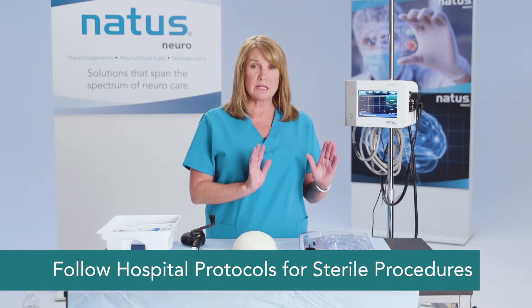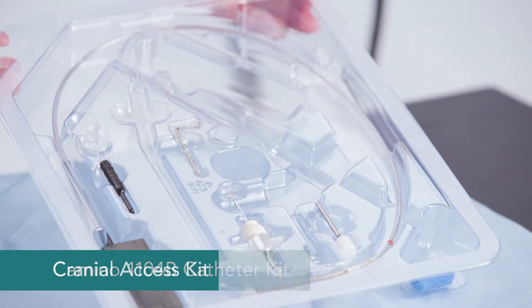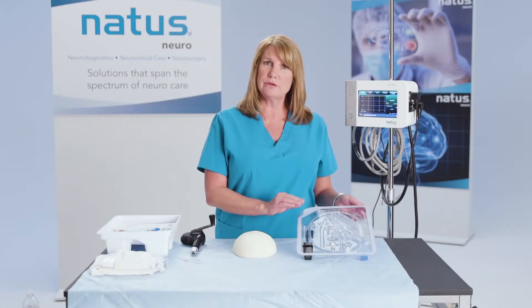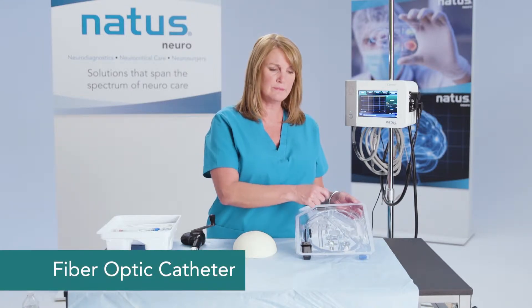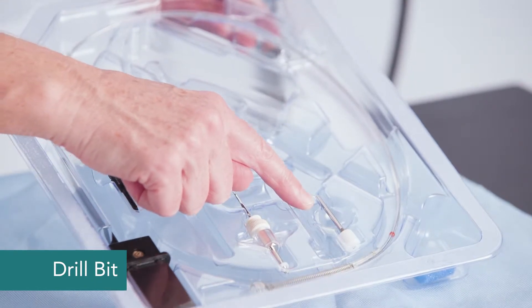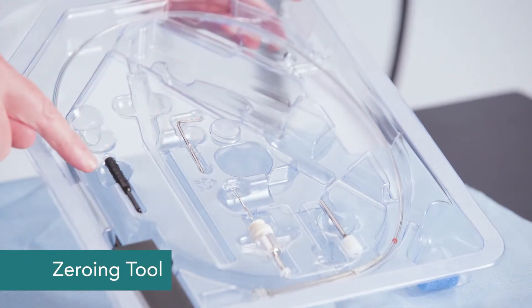There are a couple of things you're going to need. You're going to need your Camino fiber optic catheter kit, and you'll also need a cranial access kit. In your 110-4B series catheter kit, you'll find your fiber optic catheter, your drill bit, the bolting system, a hex wrench, and your zeroing tool.